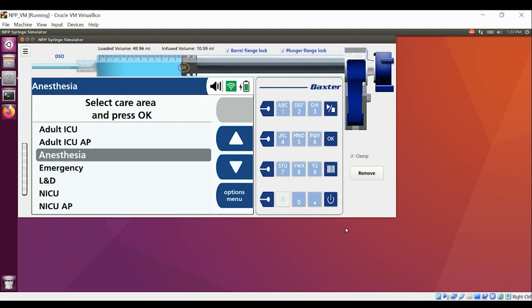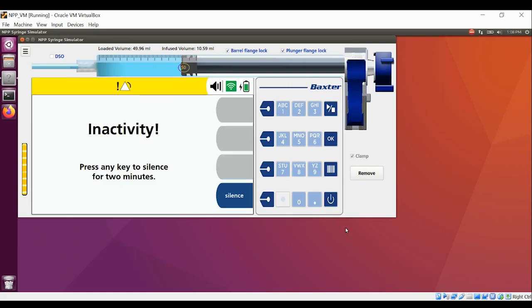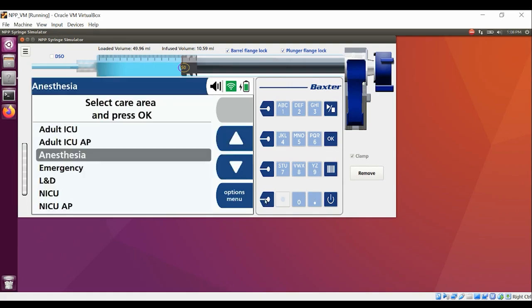The passcode is optional now, so you can either work with DoseIQ to make sure that a passcode is always required, or they can turn it off so it's not required in the anesthesia care area. Just as an FYI and to reiterate, I know that you probably are aware of this, but on the library that you have, the passcode will either be 2581 or 1527. It just depends on how your library was built as to which library you have.